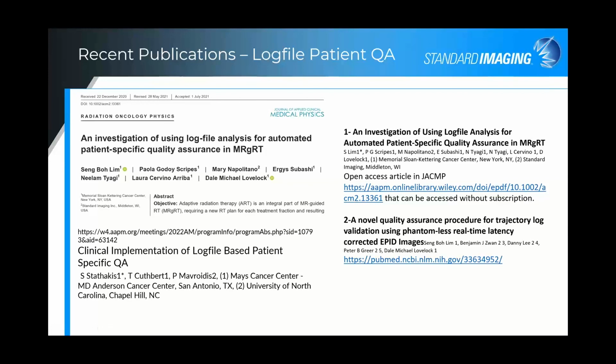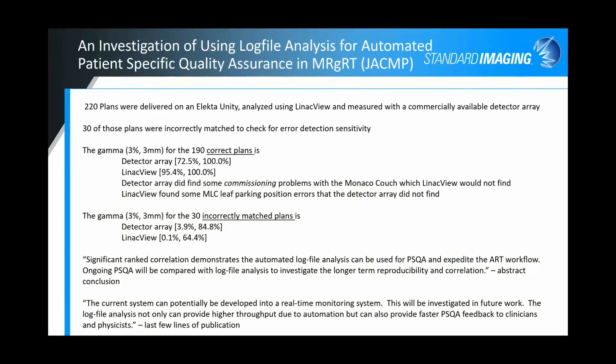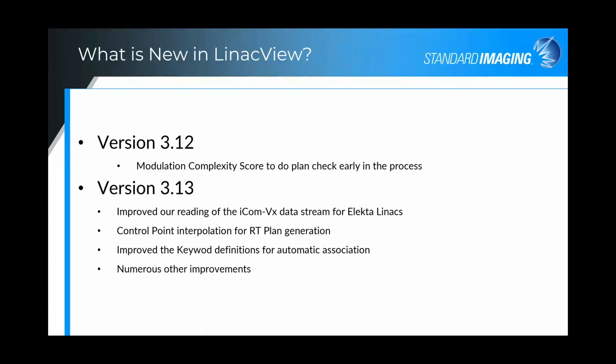If you're a little hesitant about log files, there are some publications out there telling you how to do some quality assurance for your validation of your log files, so you can be assured that you can trust the values. And I have spoken on other webinars about the patient-specific QA work at Memorial Sloan Kettering. Please reach out if you'd like to hear more details about that.